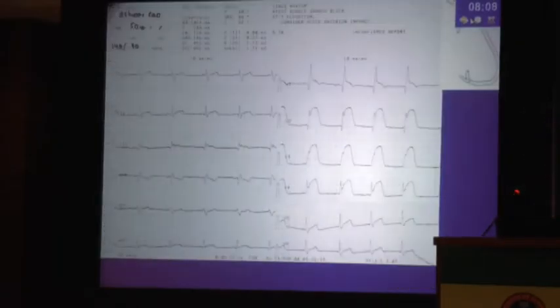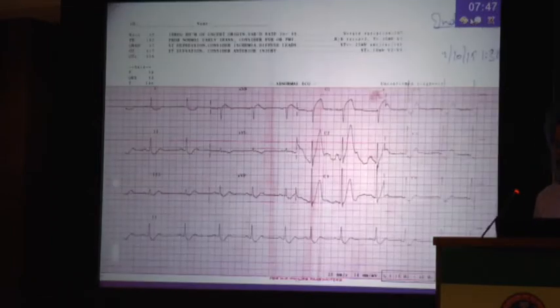So if you look at this ECG, what you have here is, anybody would like to take a take? Anterior wall. Yeah, it's an anterior infarct. It's an infarct which is not so old since the ST is still looking up. There are changes in the QRS complexes which have come, and there is a right bundle branch block. And since there is a right bundle branch block, this is a proximal LAD block.